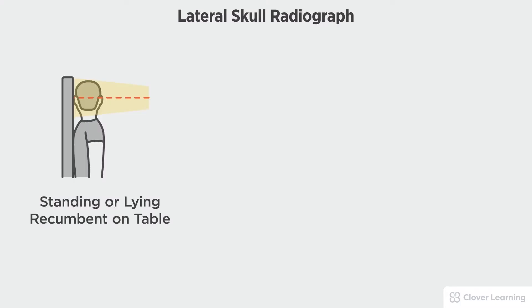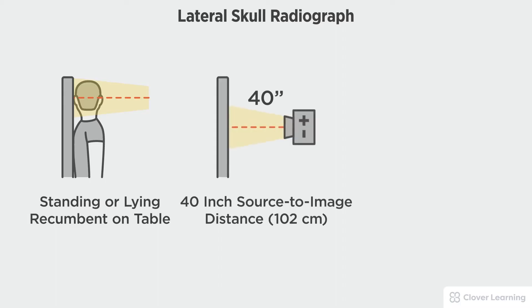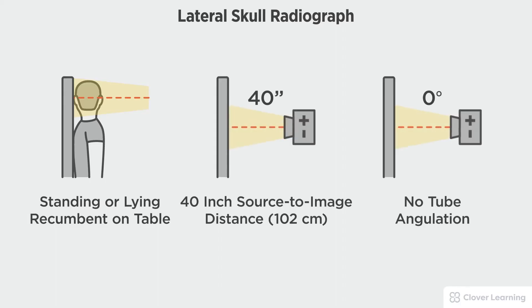In this view we will be demonstrating the lateral skull. The lateral skull should be performed with the patient standing or sitting at the upright bucky or lying on the table with a 40-inch source to image distance and no tube angulation.